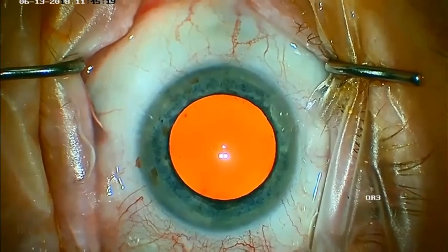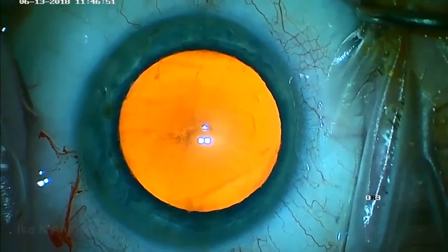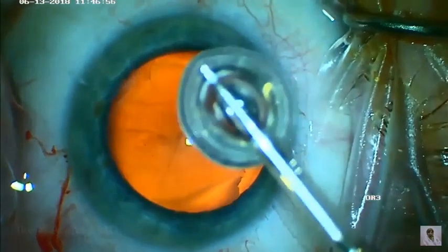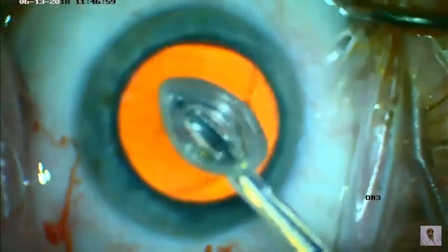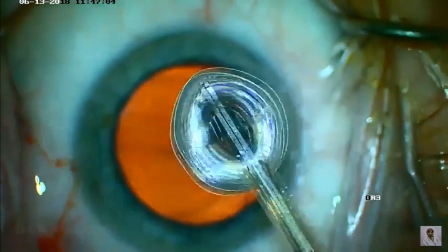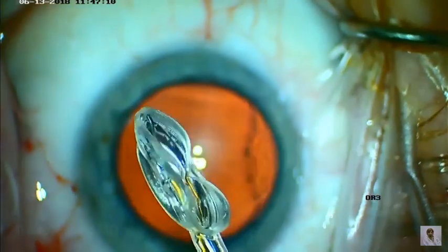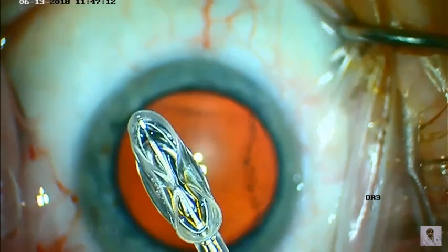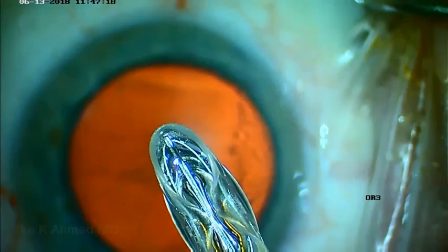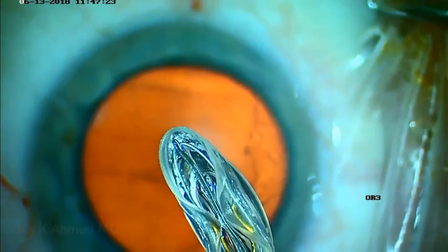This describes our initial experience with the Zepto Precision Pulse Capsulotomy device, designed to create a consistent 5.5mm circular capsulotomy. Here we're using a 2.2 millimeter incision. Examining the device, we can see the circular nitinol ring, the push rod, and the soft silicone skirt. Pushing the push rod forward engages the nitinol ring, ovalizing it — you can see it's flexible — creating a collapsible silicone sleeve and nitinol ring that allows placement through the 2.2 millimeter incision.